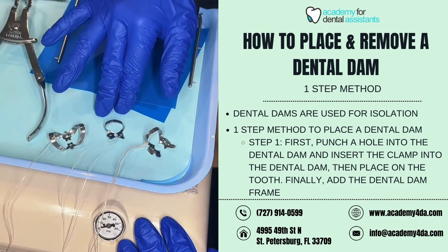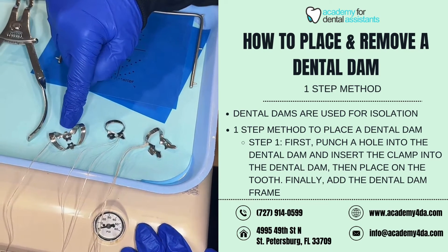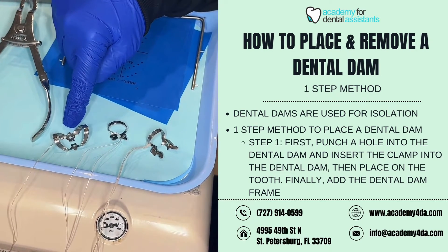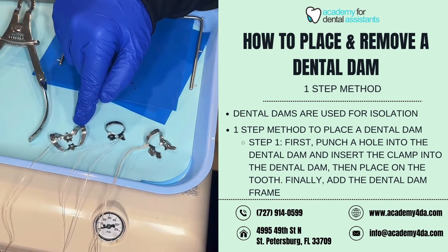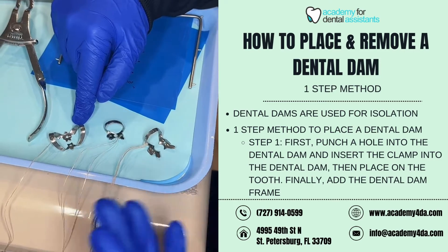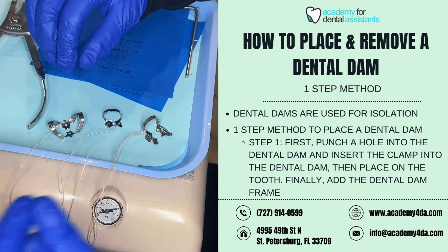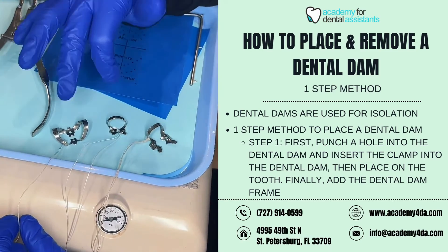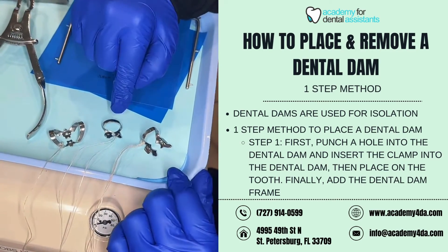These here are our dental dam clamps. This one here is going to be used for our anterior teeth. You will see that a piece of floss is tied to it as a ligature. This ligature is used in case the clamp were to fall toward the ground or go toward the back of the patient's mouth — the assistant or dentist could grab it to retrieve it.